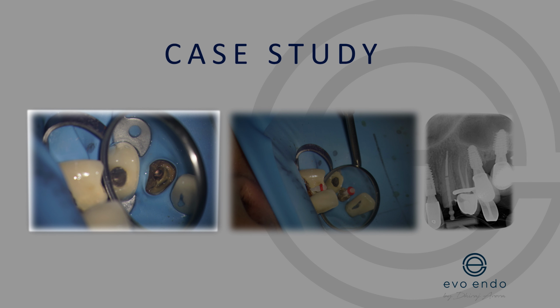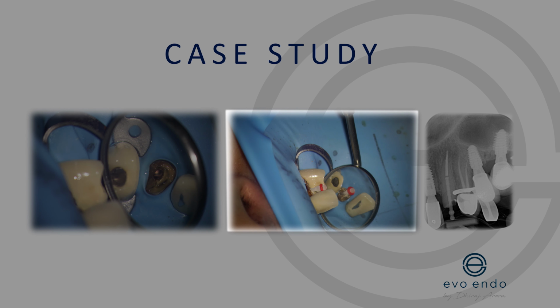Because I use heated GP, I am fortunate enough that I just burn the GP off to the level where I'm going to place the post. So in this case, the GP was melted down using the System B, and you can see the image clearly there where the GP was filled to. We then passively placed a post within the canal system. In this case, it only required a little further preparation to make sure of smooth placement.